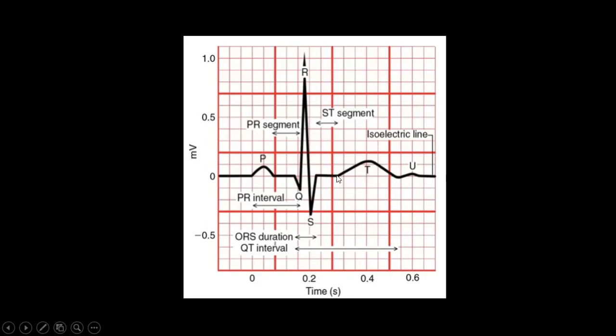In old age, this T wave is usually flattened. Then in hyperkalemia, that is whenever the potassium concentration gets elevated, tall and peak T wave can be observed. Exercise increases the amplitude of T wave in healthy hearts. An inverted T wave is an indicator of myocardial infarction.